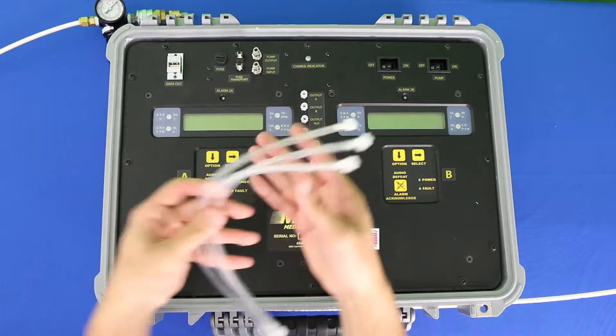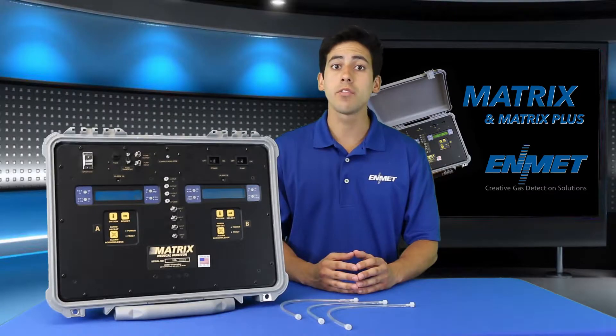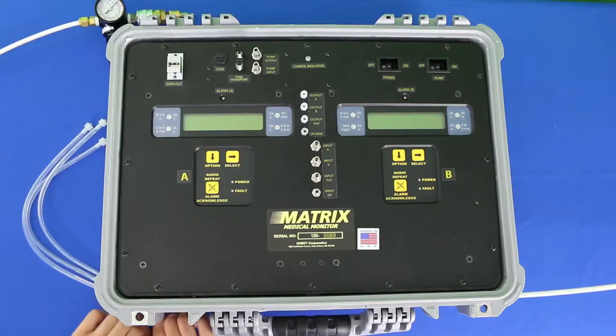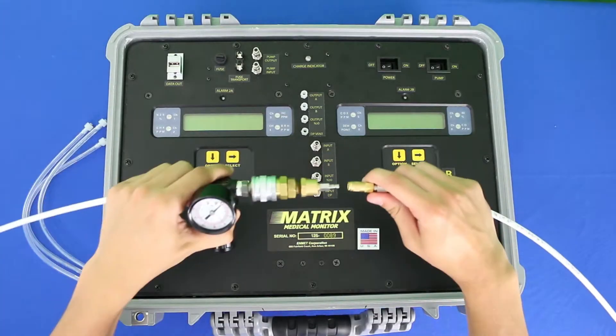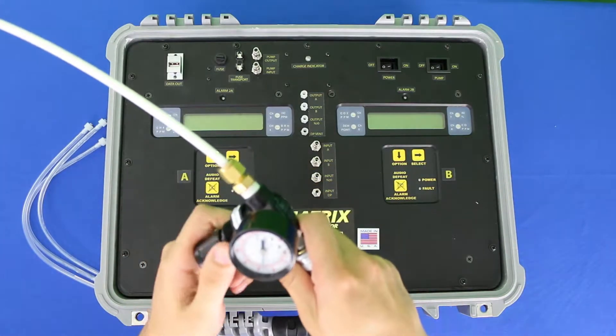serially so that clean air is flowing through each air circuit. After connecting your clean air supply, connect your pressure regulator inlet to your sample source and adjust to 55 psi.